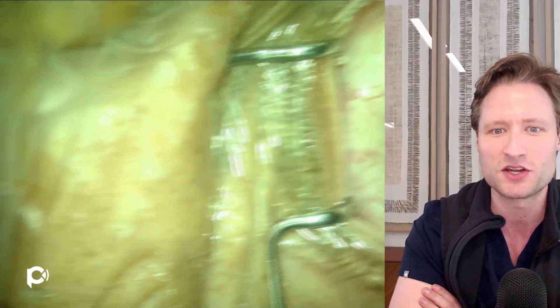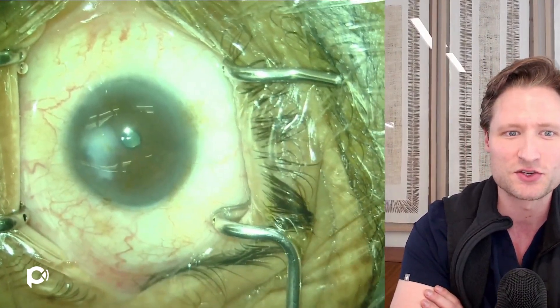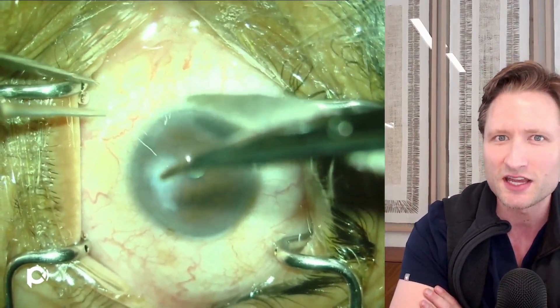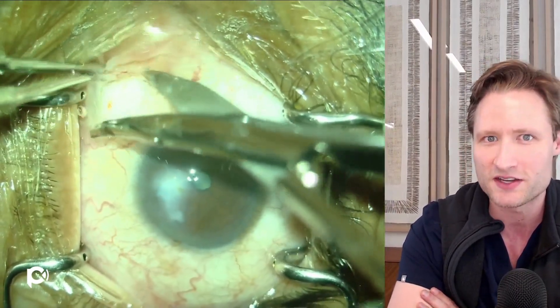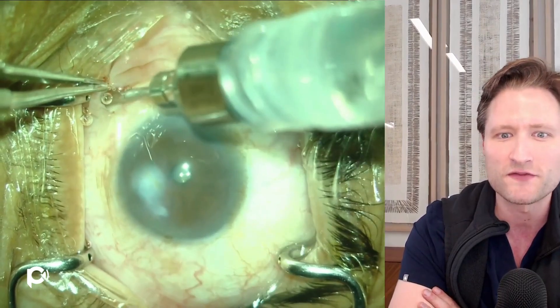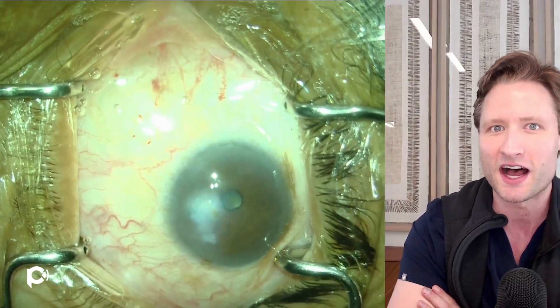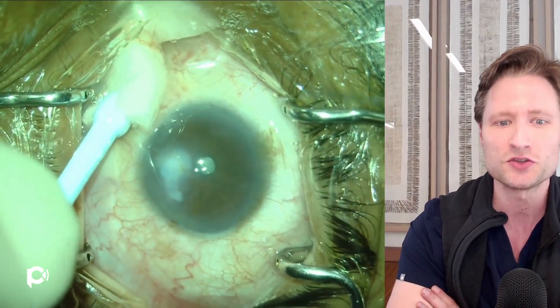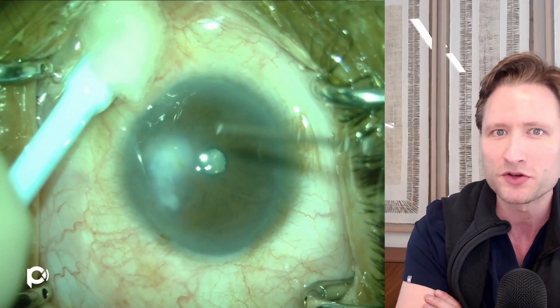This is the eye as presented on the operating room table. This patient is awake, and we're about to begin his surgery with a subtenons block. This is my preferred type of anesthesia for most of my DMEK operations because it's so quick, easy, and effective. Importantly, this is a phakic eye in a young patient, so you expect some degree of posterior pressure, which you don't want to compound by giving a large bolus of anesthesia posterior to the eye.